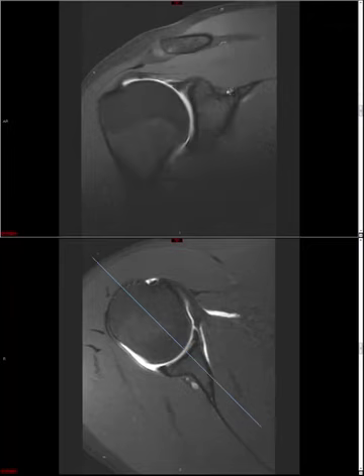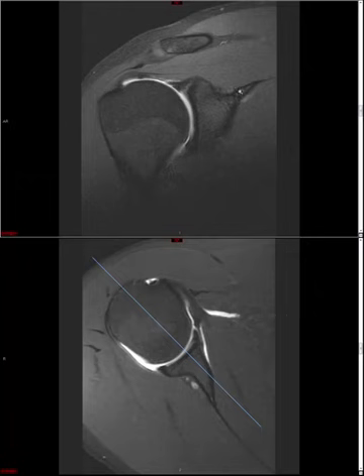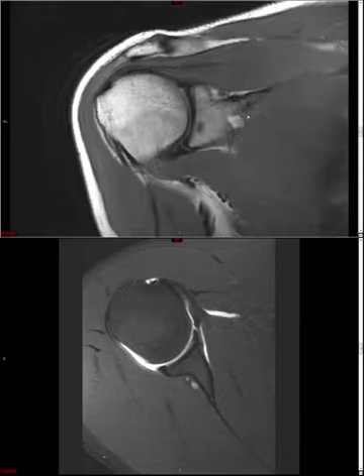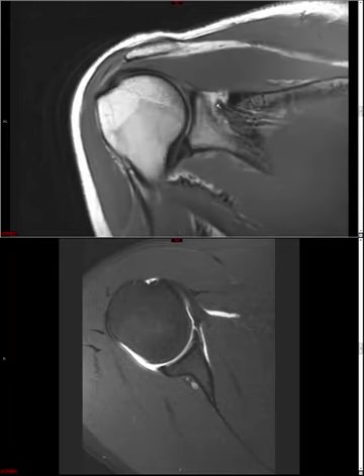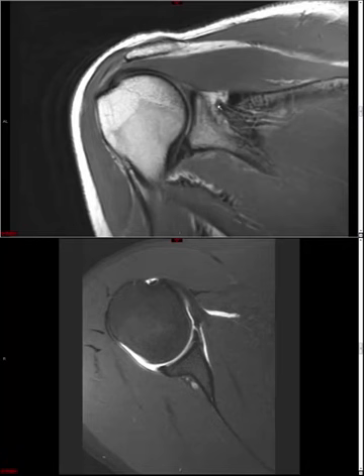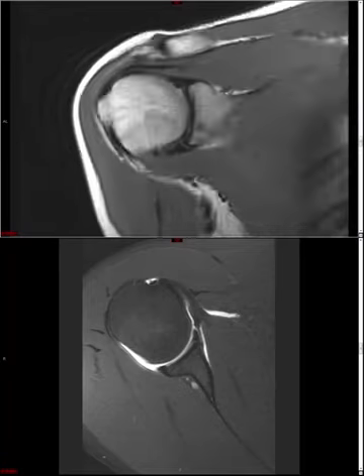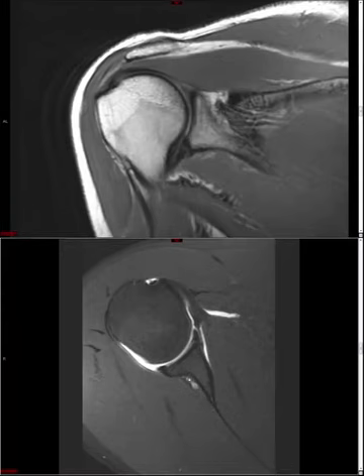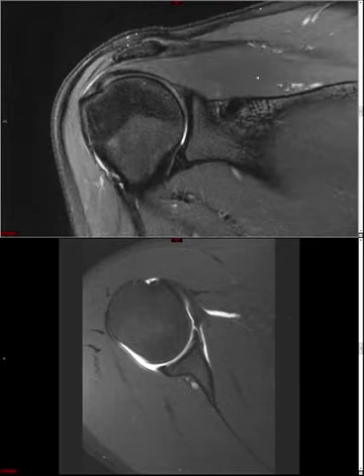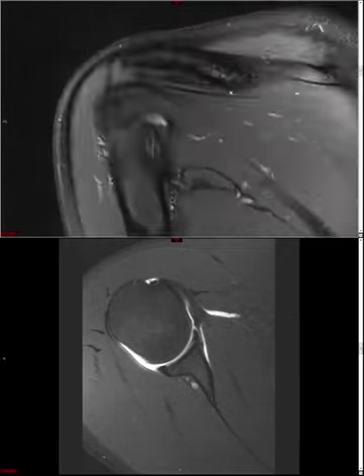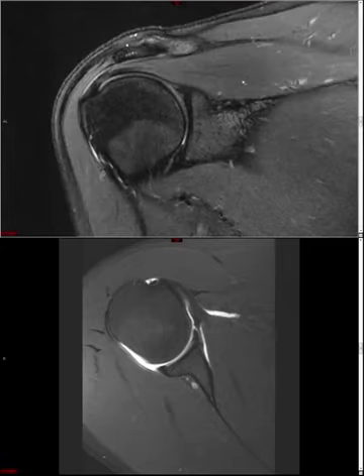If there is a paralabral cyst, note if it extends into the suprascapular notch or spinoglenoid notch. Here on a far anterior coronal image is the suprascapular nerve in the suprascapular notch — it innervates supraspinatus and infraspinatus. Scrolling posteriorly, the notch becomes the spinoglenoid notch, where the suprascapular nerve only innervates infraspinatus. If a paralabral cyst insinuates into one of these notches, go back to your fluid-sensitive sequence and look for diffuse edema or fatty atrophy in supraspinatus or infraspinatus — important secondary signs of suprascapular nerve entrapment.